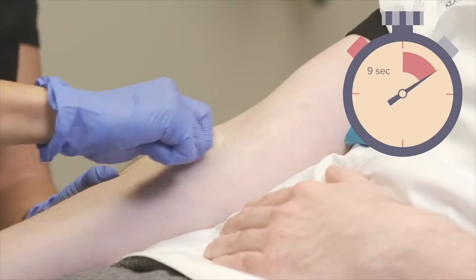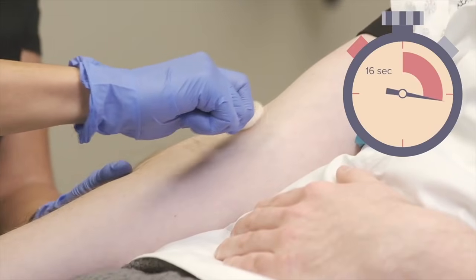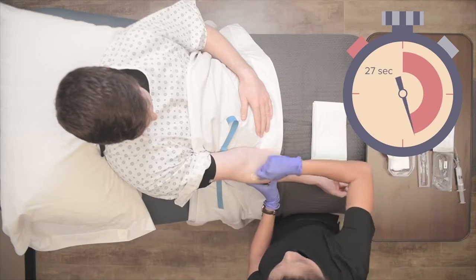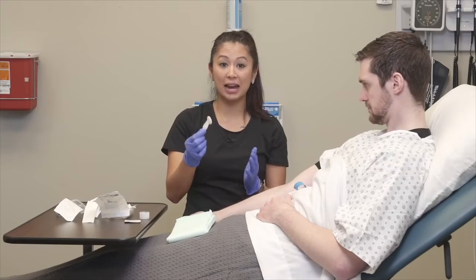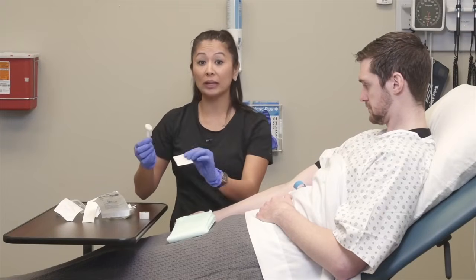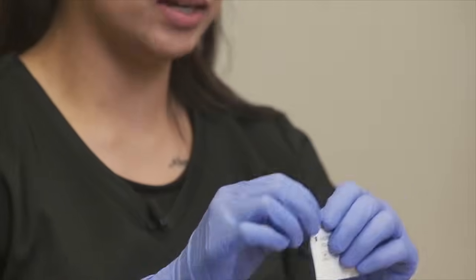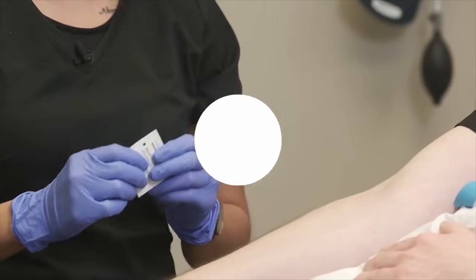So as you notice, I'm using a nice circular motion, and notice I'm not just cleaning the site, I'm cleaning everything out and around of where that possible transparent dressing and where I'm going to be. So this is ChloraPrep. Now, some kits may come with what we call an alcohol pad, which is really common for most of our procedures. So you can also do the same thing with an alcohol pad. Open this up and do the same sort of circular outward cleaning.